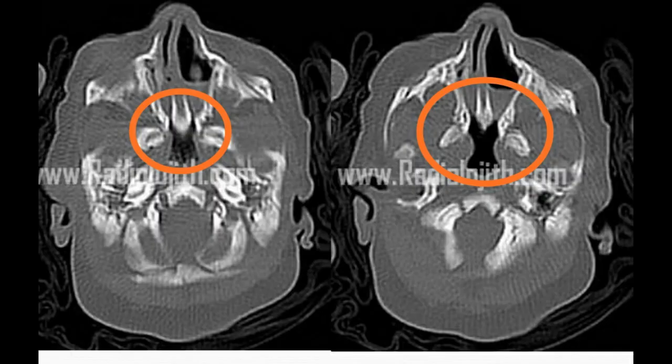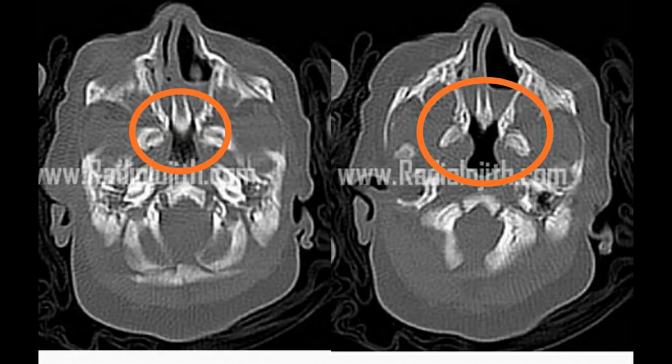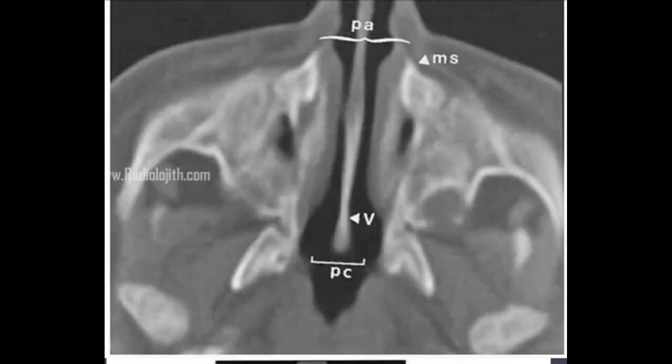Now we'll go to the second one, which shows significant narrowing of the posterior nasal choana with a highly thickened vomer. The obstruction is pronounced more on the left side with an obstructed fluid level. The anterior nasal process of the maxilla appears patent with no overgrowth here, and there is no narrowing of the anterior pyriform aperture. Bony overgrowth looks more pronounced than the membranous part, if compared with the CT PNS morphology of the normal newborn baby you have seen.